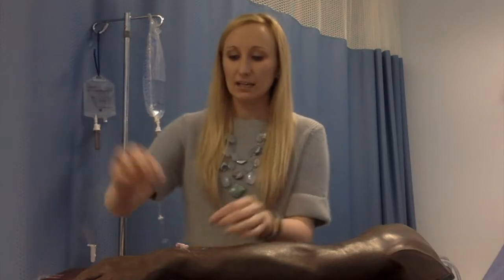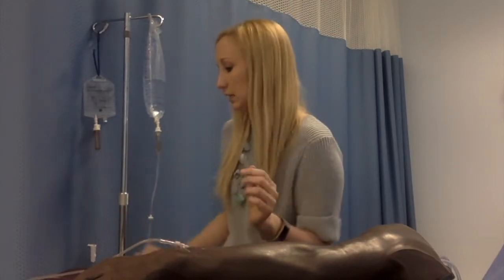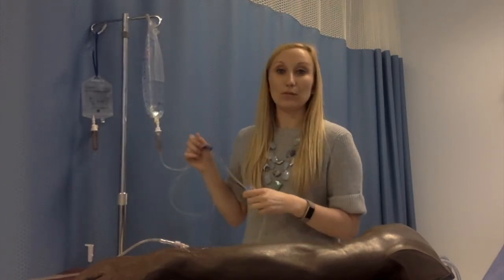It's long. It connects to our main bag. So I'm going to attach it to our patient. Make sure to keep it sterile and clean. And then you can just unclamp it and let the fluid flow through to the patient.